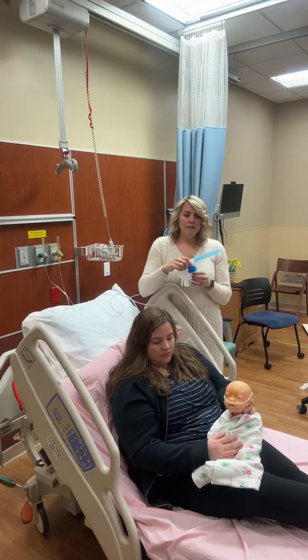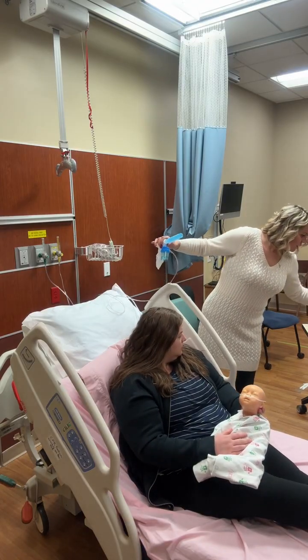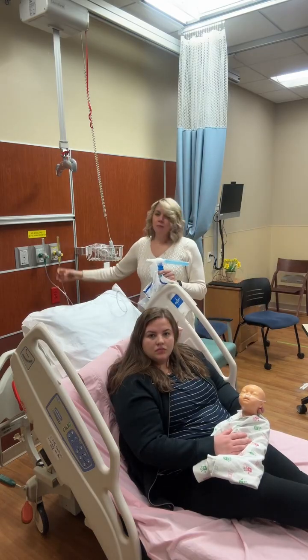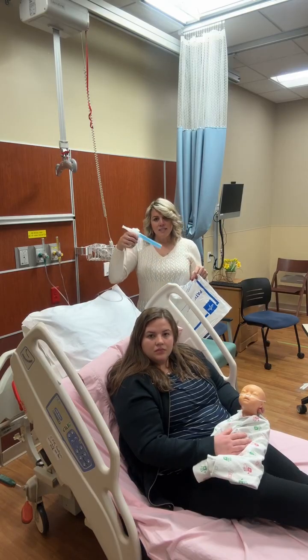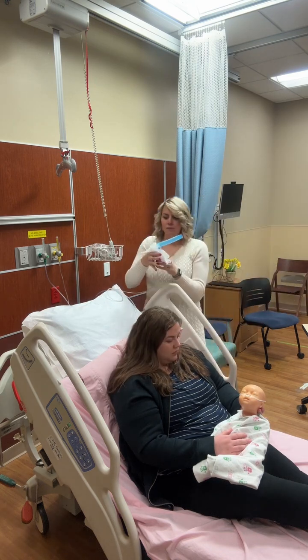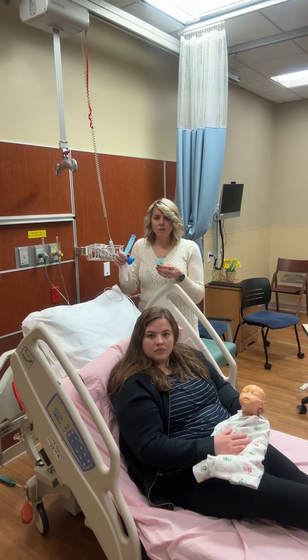And typically there is a bag. So we have patient belonging bags, or you may see a bag like this, or you may see a respiratory patient belongings bag that is hanging on one of the flow meters. And typically the nebulizer kit setup is inside there for the patient. When you get done, usually we like to air dry this. We'll rinse it out with some water and then stick it on a paper towel to let it dry out.